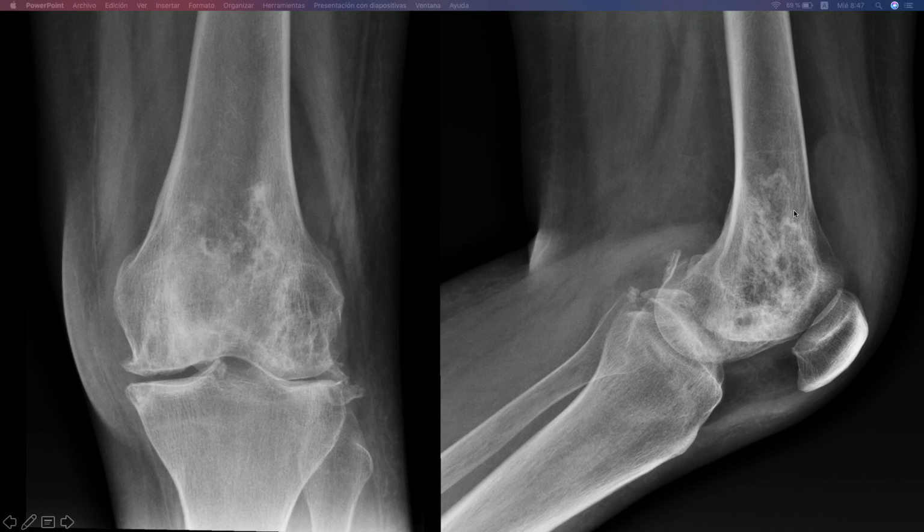But the finding that called our attention the most was this inhomogeneous area of sclerosis in the metadiaphysis, which we could describe as patchy or diffuse with serpiginous pattern of sclerotic borders.